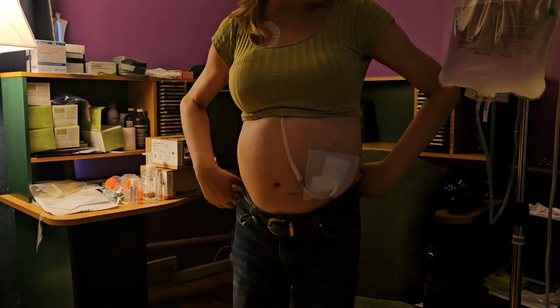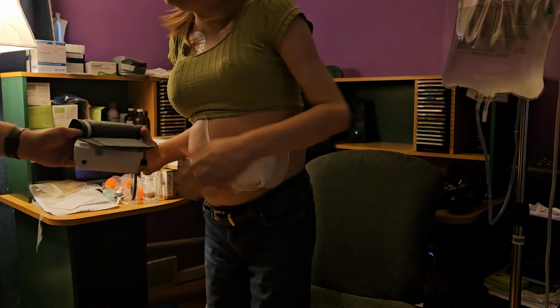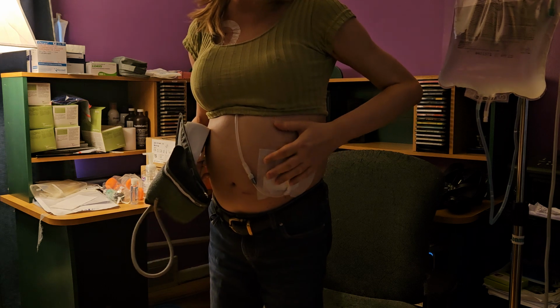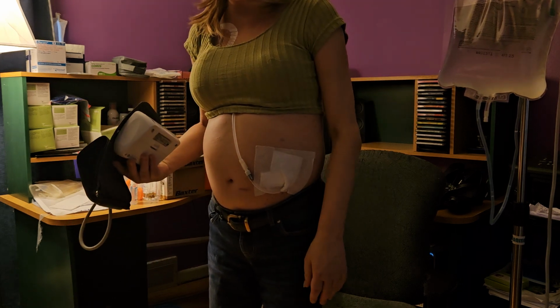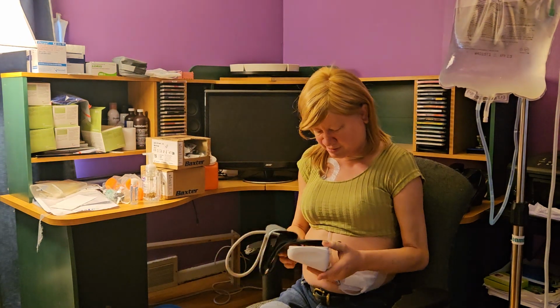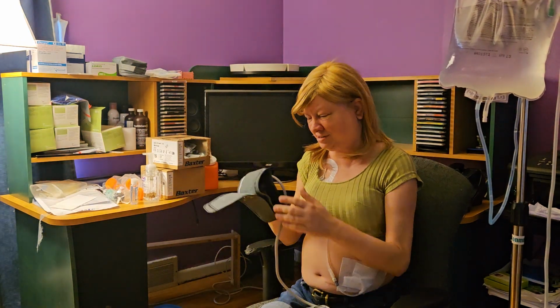This is what home dialysis is going to look like. This is all the fluid that's in my stomach. That's why I look really fat. It's supposed to record blood pressure.